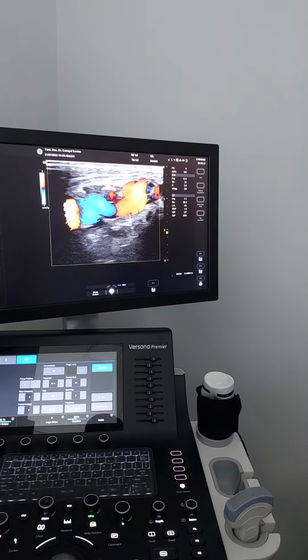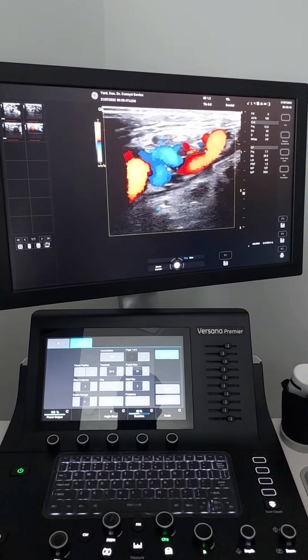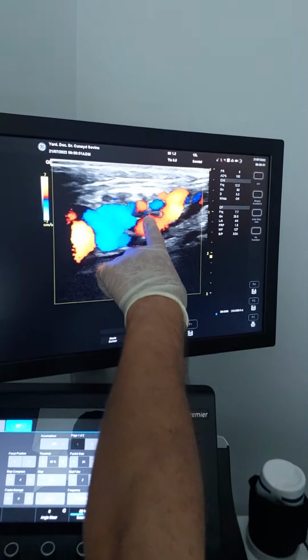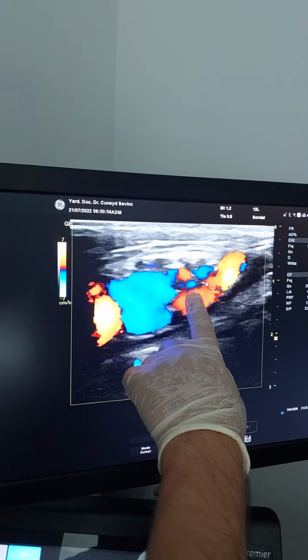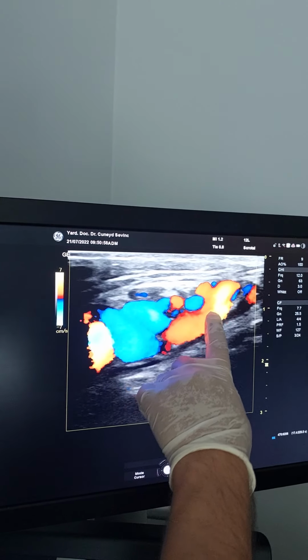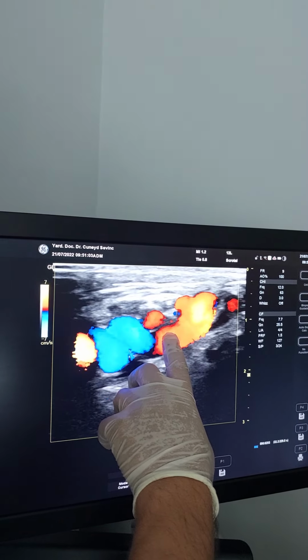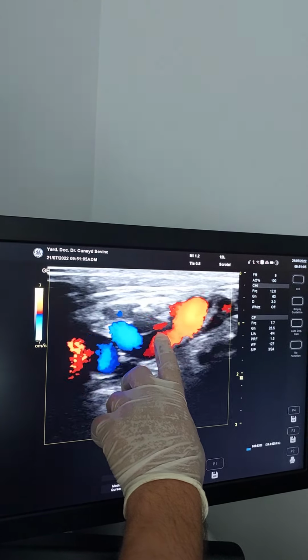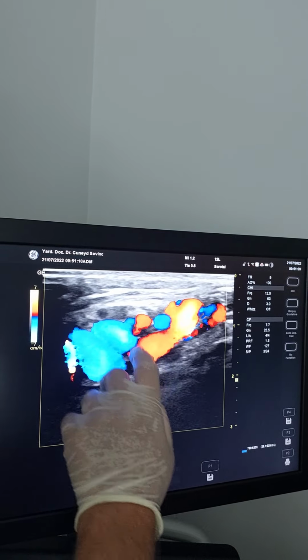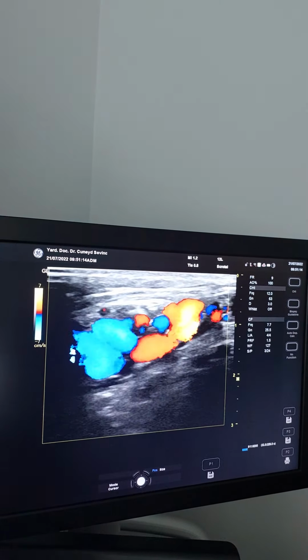And inside the operation, we use intraoperative Doppler, microvascular Doppler, because you see there is an artery. Look at this. Very thin. Very thin. It's very difficult to find this one. It's pulsating. In the operation, these vessels are obscuring this one. It is surrounded by veins. So with only the microscope, sometimes it is not very easy to find this. We check all the vessels. Here is another artery pulsating.